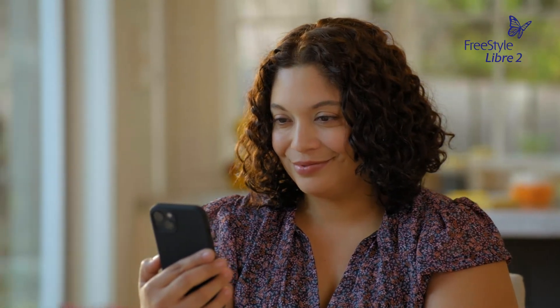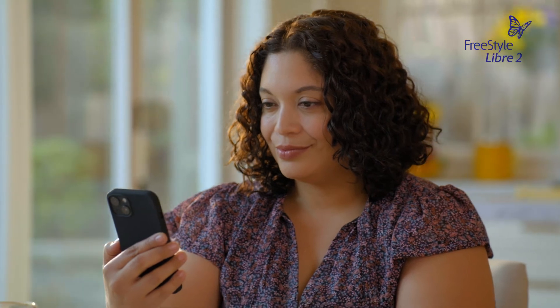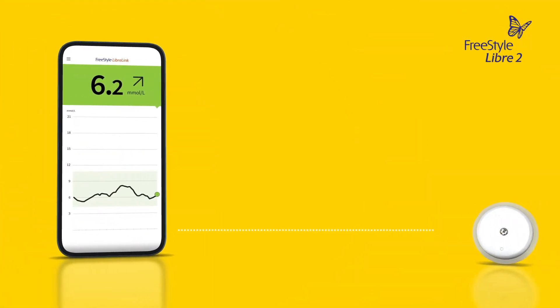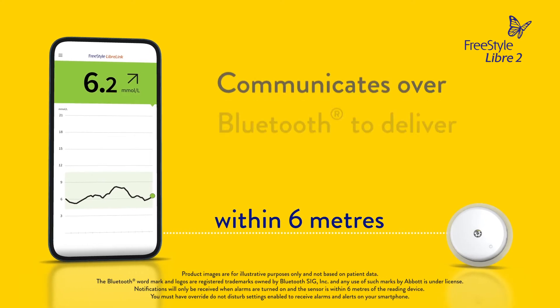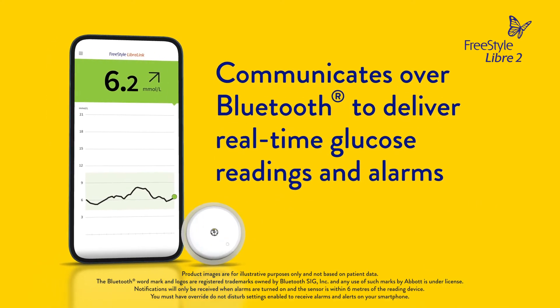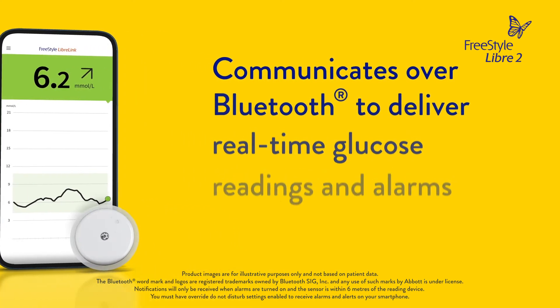Be sure to turn on Bluetooth wireless technology before starting a new sensor. When your smartphone and your sensor are within six meters unobstructed, they will automatically communicate to give you real-time glucose readings and glucose alarms if you have your alarms turned on.